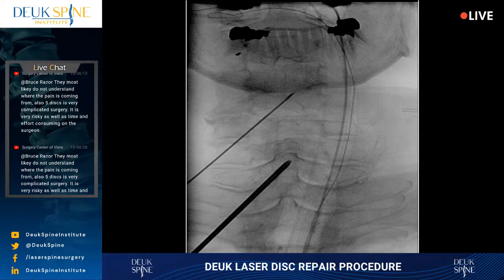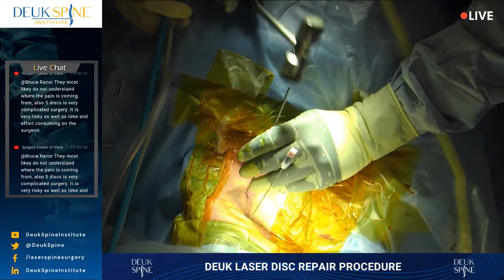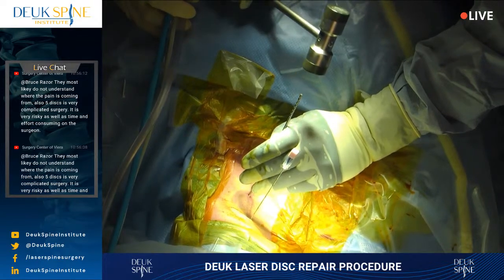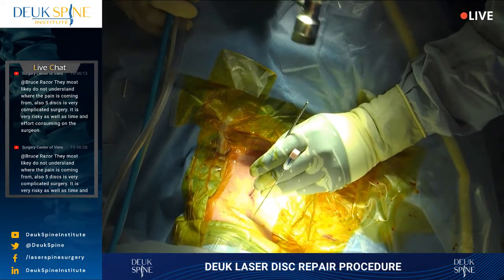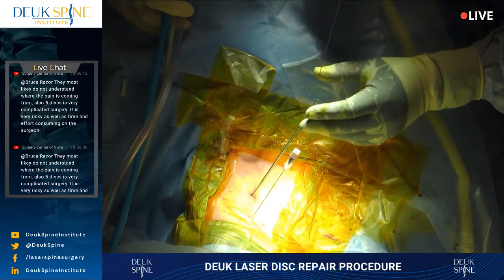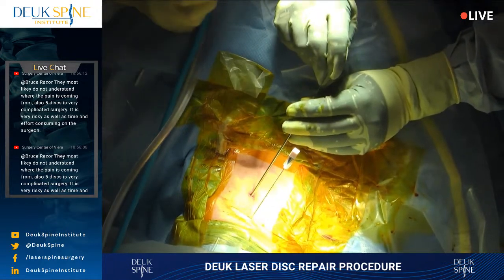So this technique you're seeing is the one that I've developed here at Deuk Spine years and years ago, and you won't find it anywhere else in the world unless they're copying my technique, which is entirely possible. All right. Shot. So we're going to do a discogram now. And this procedure is called the Deuk laser disc repair, in case you're wondering. You can read about it.